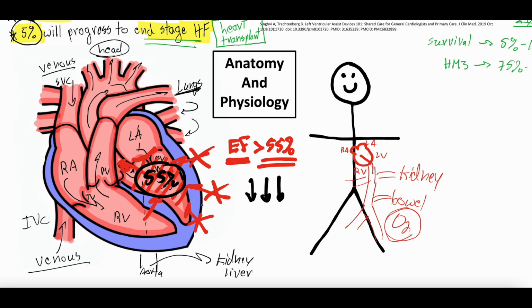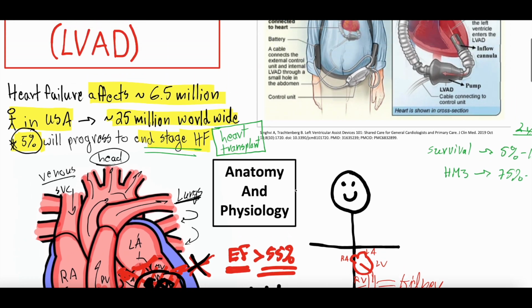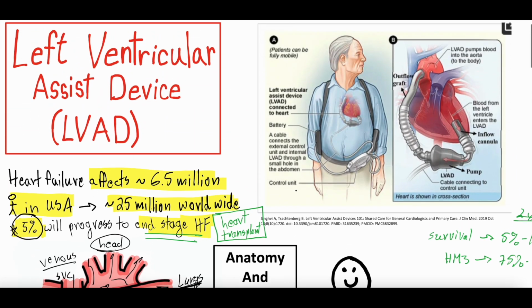And you can imagine, right, if your ejection fraction is only 10%, you have severe systolic heart failure because you're only ejecting 10% of the blood out of this left ventricle. The rest is just sitting in there because you have a weakened squeeze, a weakened heart. And that's where the left ventricular assist device comes in, the LVAD, right? Because that left ventricular assist device helps pump blood around the body.